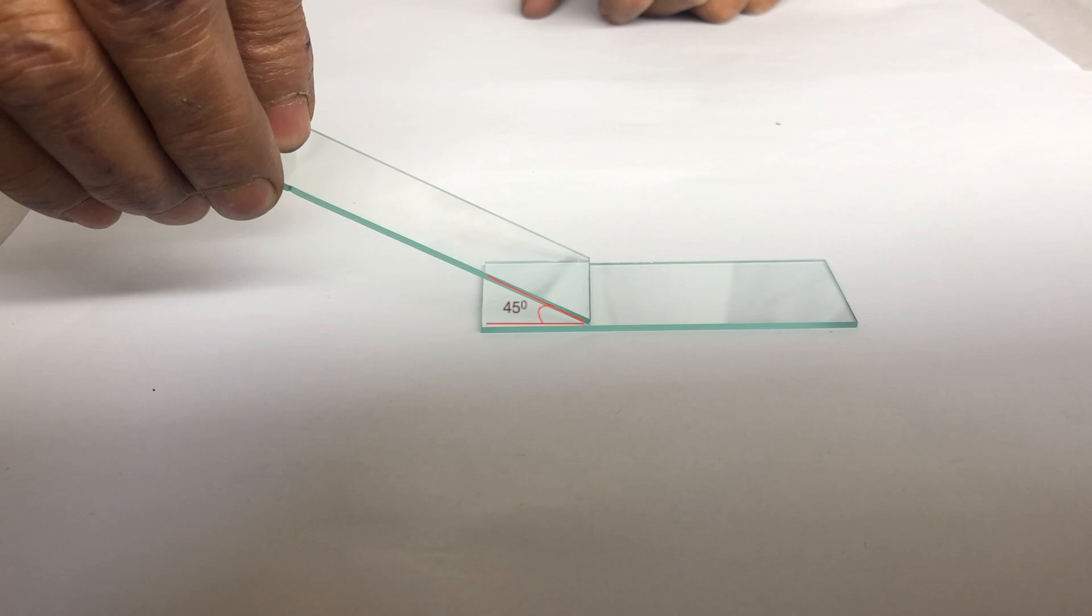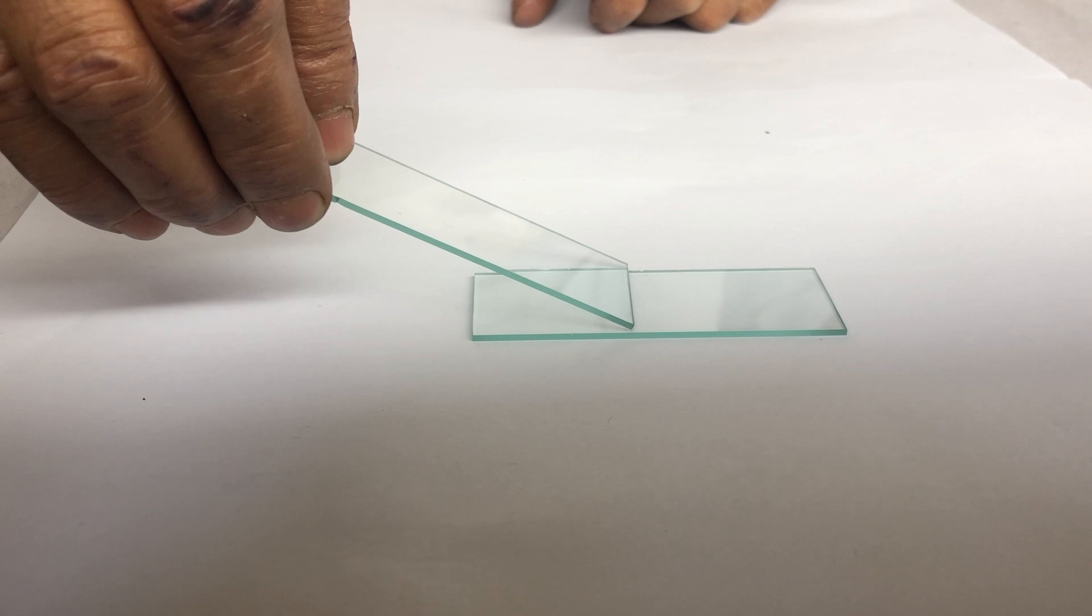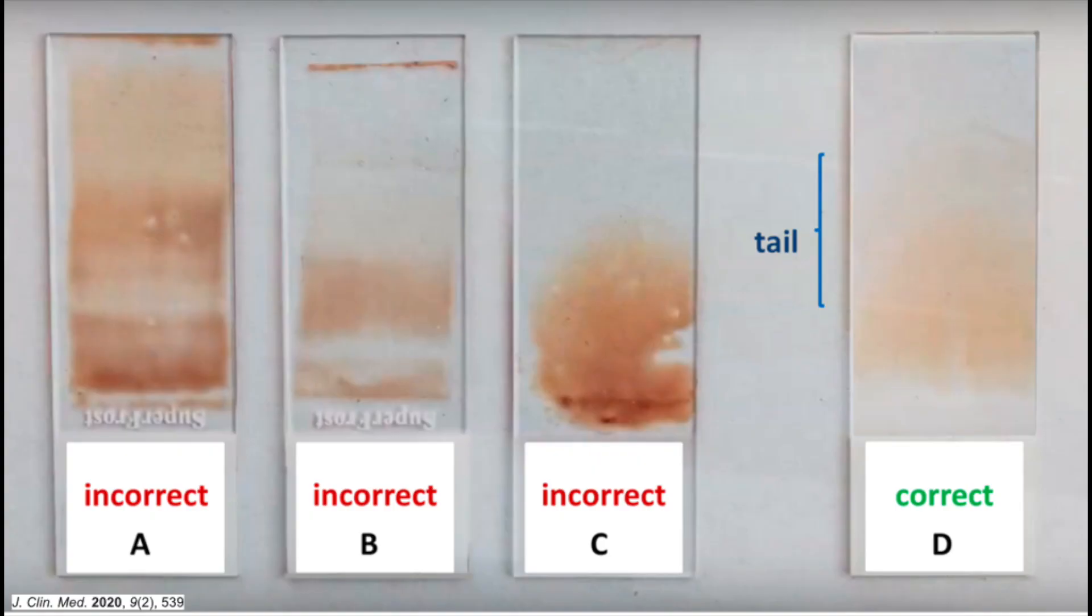Angle is very important for making a good film. Try to hold the spreader at around 45 degrees. The lesser the angle, the thinner and more uniform your film would be.